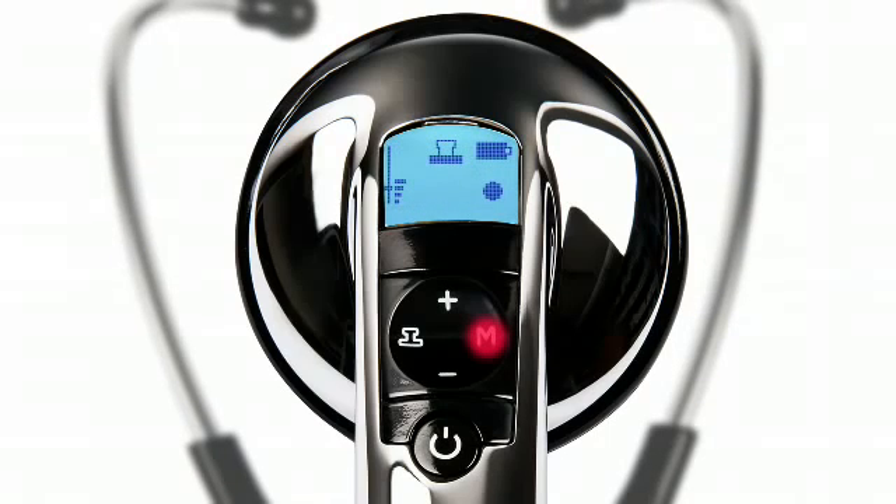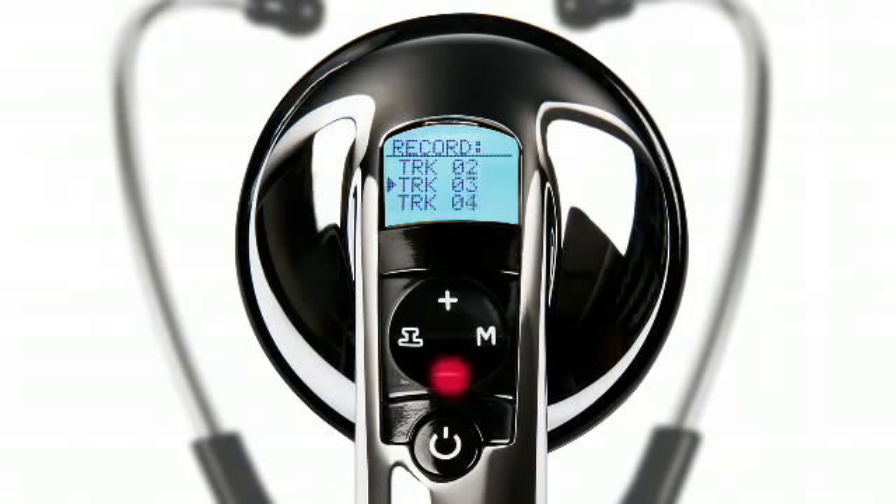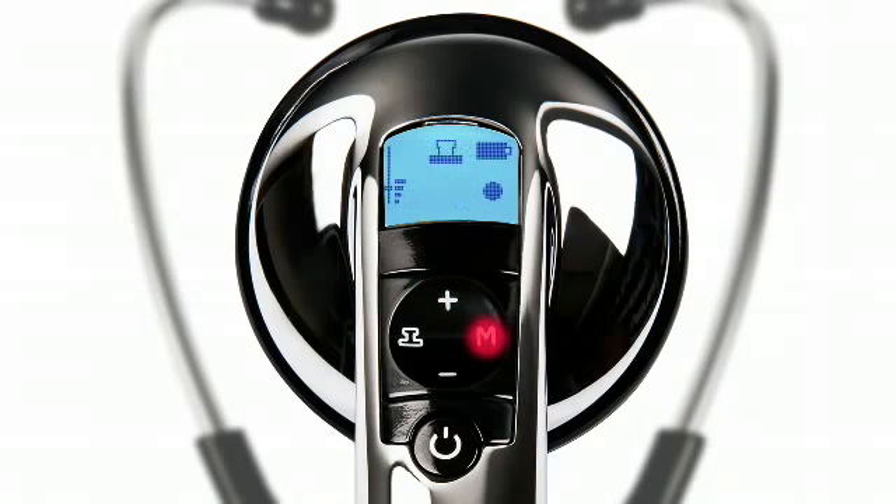The single-track stethoscope will begin recording immediately. For the 12-track version, use the plus or minus buttons to scroll to the desired recording track and press the M button to begin recording.